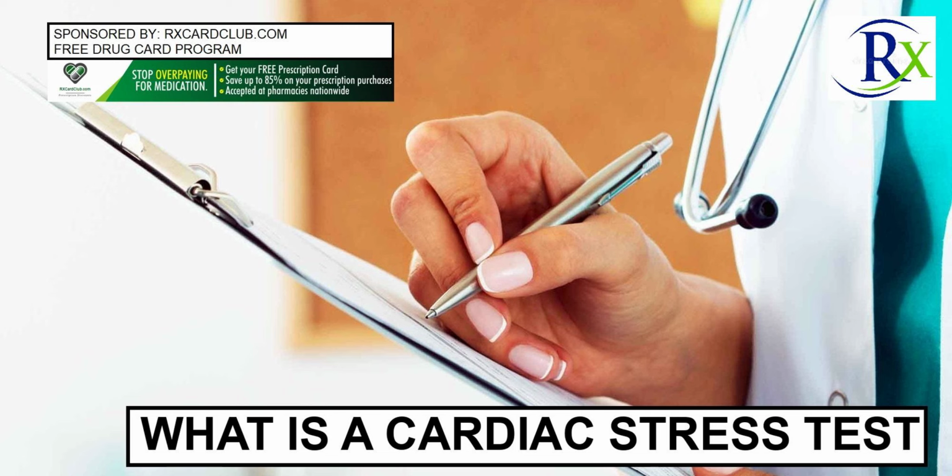When scheduling the stress test, advise your cardiologist about any medications you may be taking, whether they be prescription, over-the-counter, homeopathic, traditional, or nutritional. In some cases, the drugs may interfere with the accuracy of the test. These include any medications containing caffeine, which can increase your heart rate and blood pressure. Examples include weight loss pills, alertness tablets such as NoDoz or Vivarin, and caffeine-bolstered pain relievers like Anacin or Excedrin.